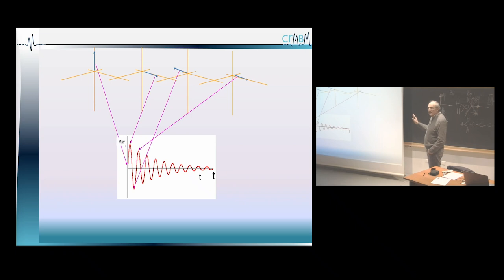And this is exactly the NMR signal, but it doesn't look like an image, and it doesn't look like a spectrum, and before I showed you spectrum and images, okay? So you remember that the proton or any kind of nucleus is precessing around Z at a given frequency. So this is what you are looking for.